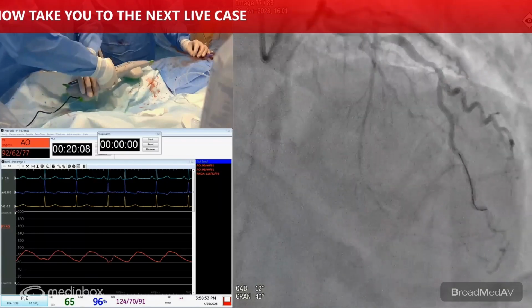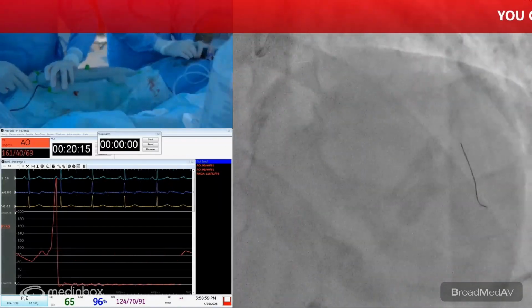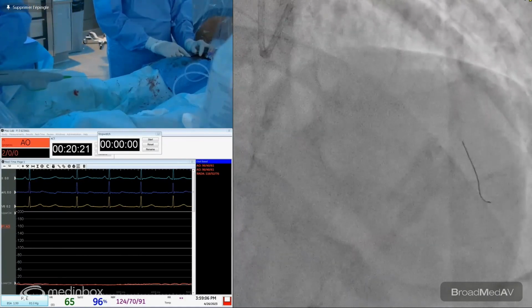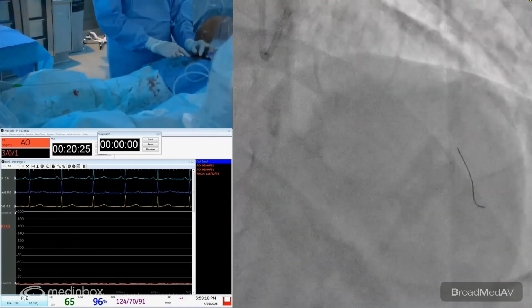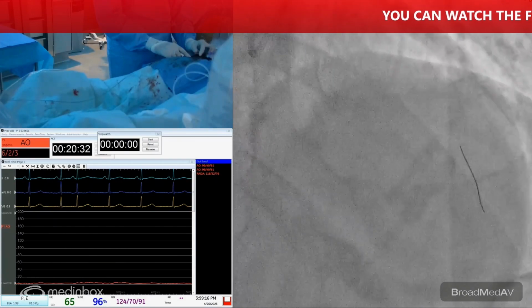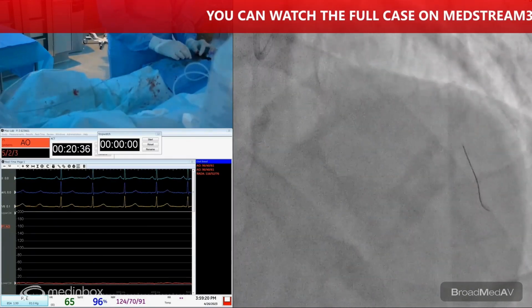Continue. So we'll go on glide assist to remove the burr, open up, fluoro, make sure you have a good look on that wire, not to lose position. Then out you go. After this, I will wire the circumflex, start ballooning, and probably my left main strategy here will be a mini crush or a TAP, depending on the angle that I see after pre-dilatation.